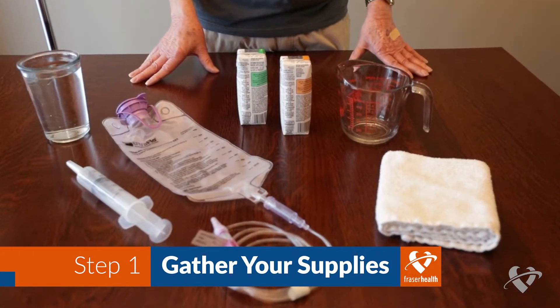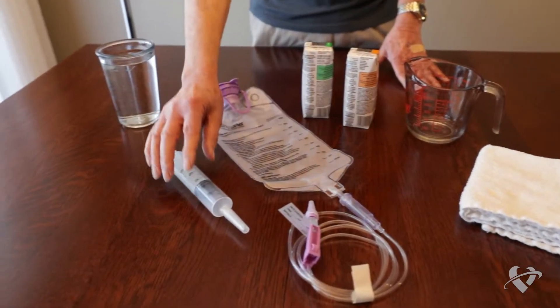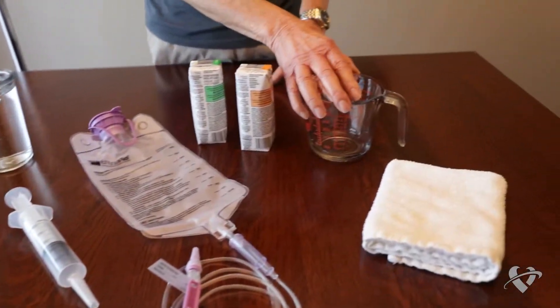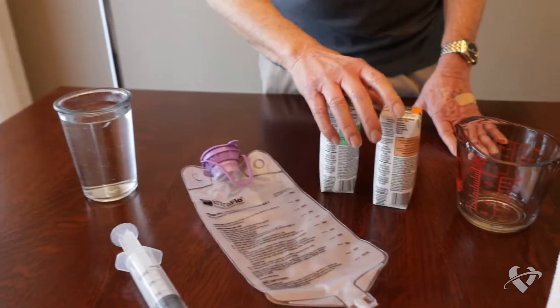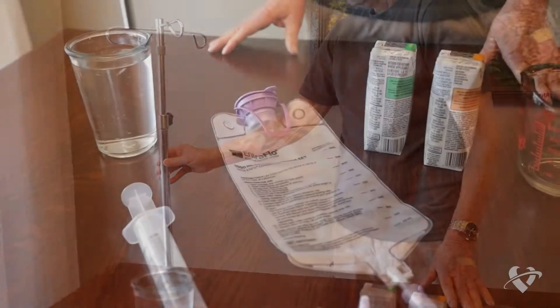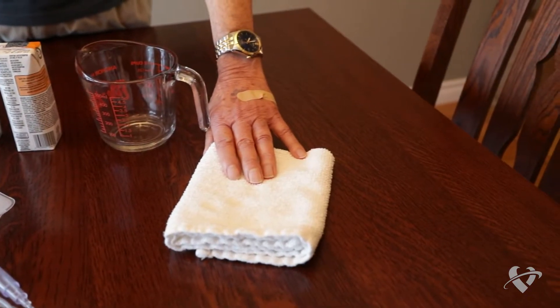To make the process easier, gather all of your supplies before you begin your feeding. You will need one syringe, a measuring cup, a container filled with room temperature tap water, your formula, an IV pole, a feeding bag with tubing attached, and a small towel to cover your lap to catch any drips or small spills.